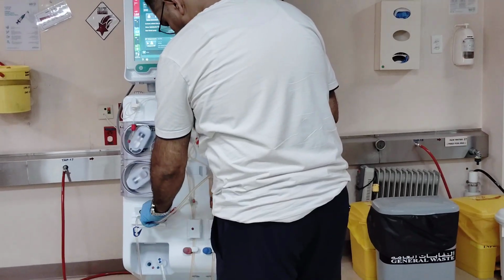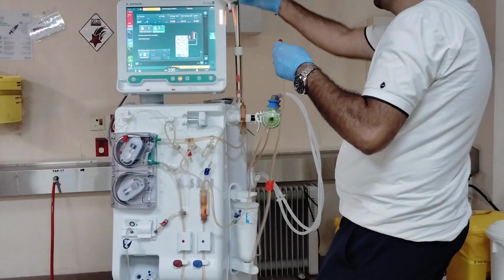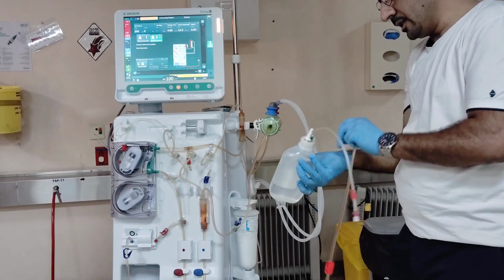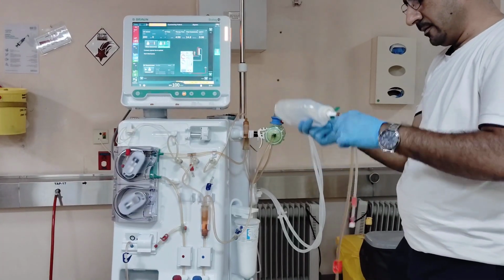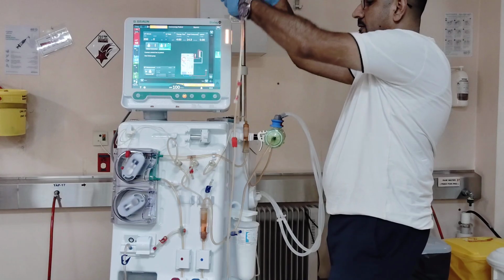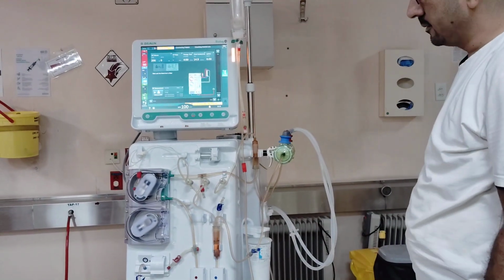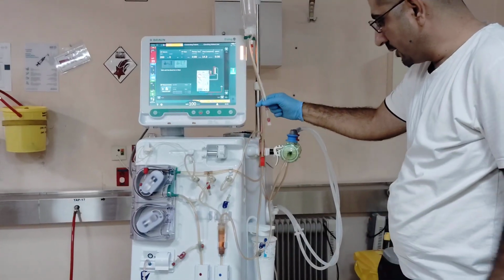Red connection. I will take the arterial line and connect it with our patient. Open, and start the blood pump. Now we will start taking the blood from the patient.